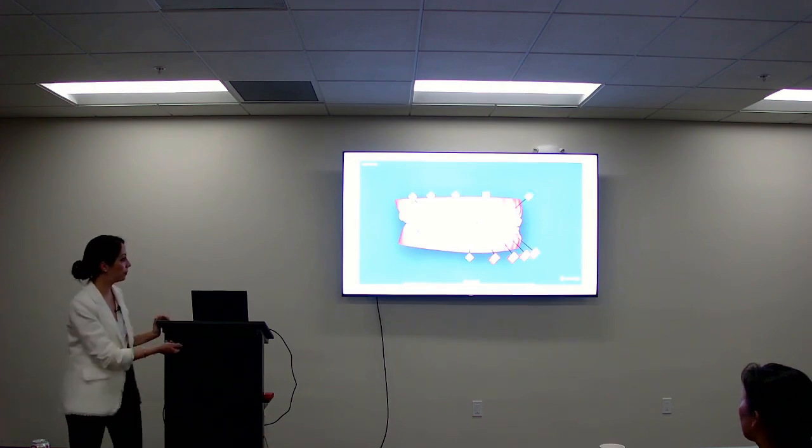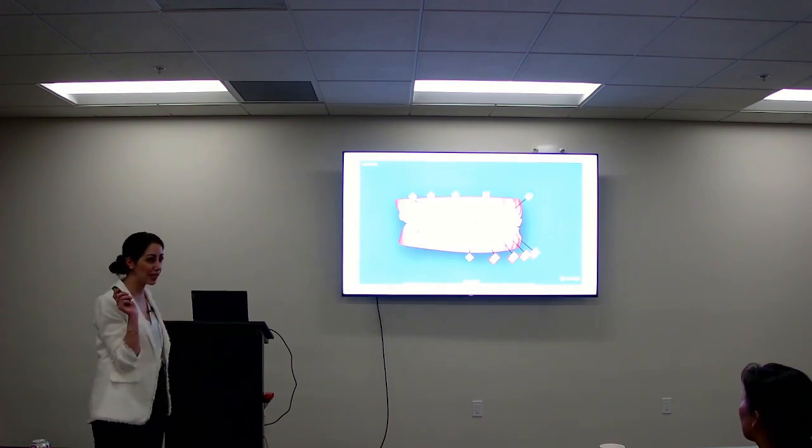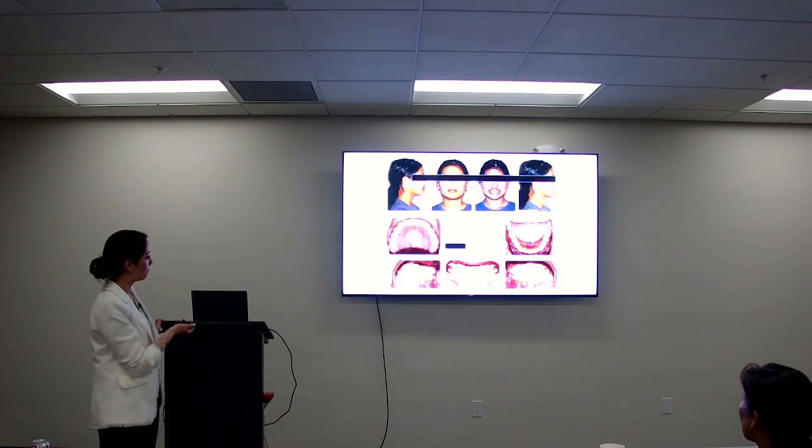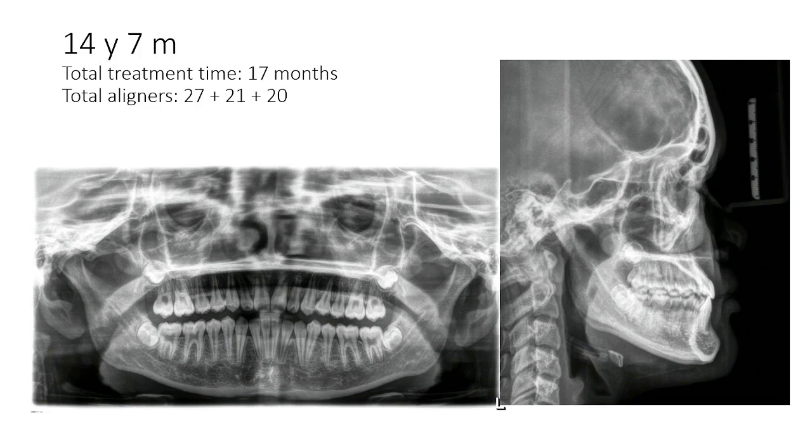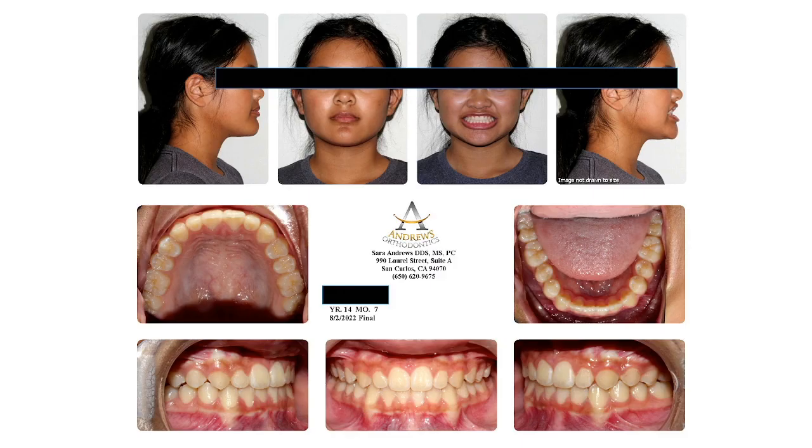So don't be afraid of spaces. Educate your patients. Okay, this is how she finished. I think she finished really, really nice. And she has positive overjet. So this is what I wanted to show you guys. So I think I did a wonderful job. I'm like, oh, I'm so good at what I do.